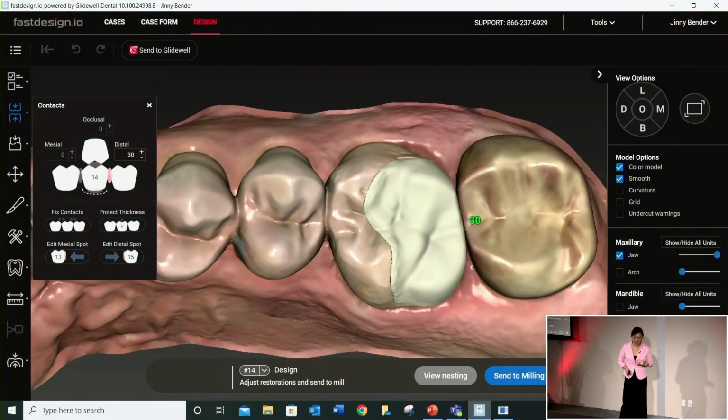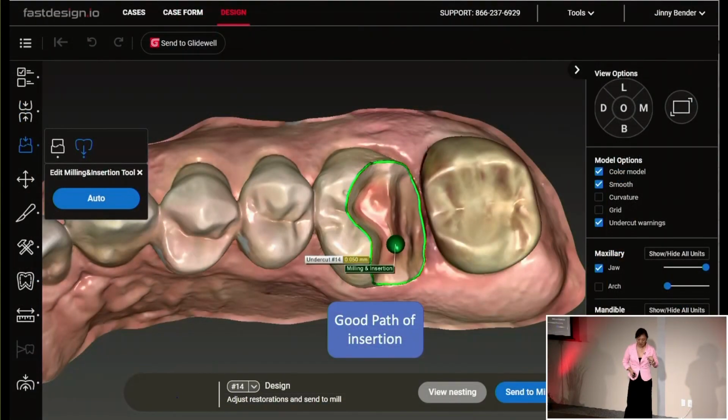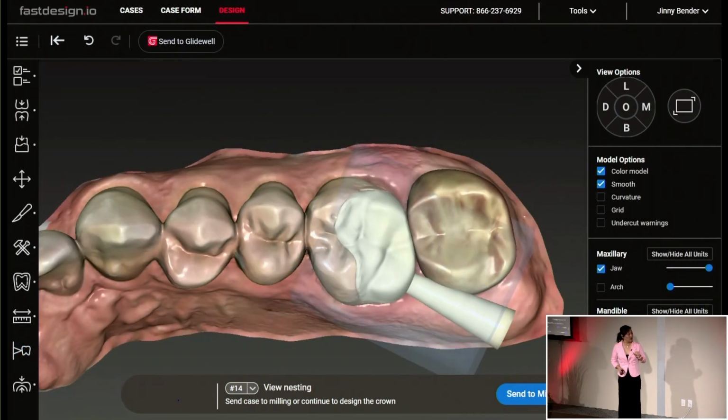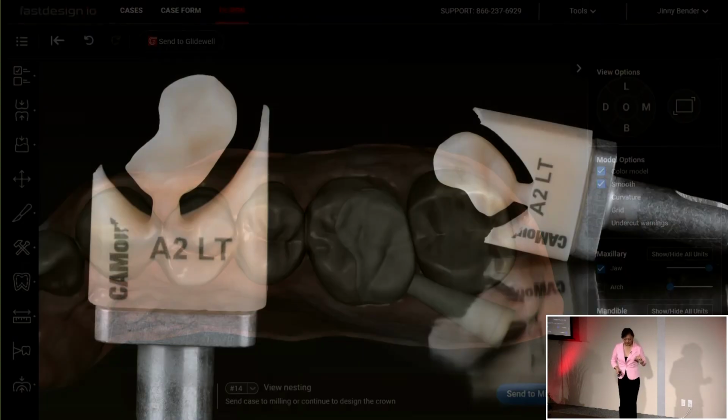And here is the restorative proposal. I just made sure that the contact on the distal was a little bit broader, to make sure that he can eat food without getting a food trap there. And again, always check that path of insertion. And I also check where the location of the sprue is. You can check it without the quadrant or with the quadrant, and then it's nesting inside the block.